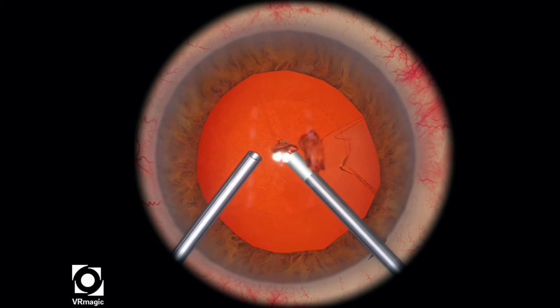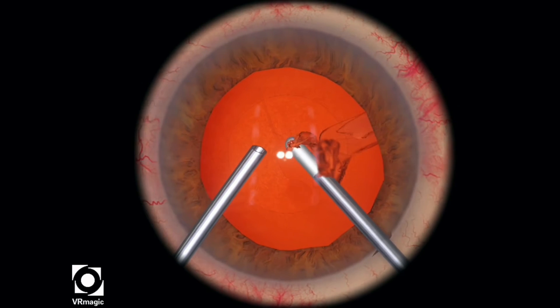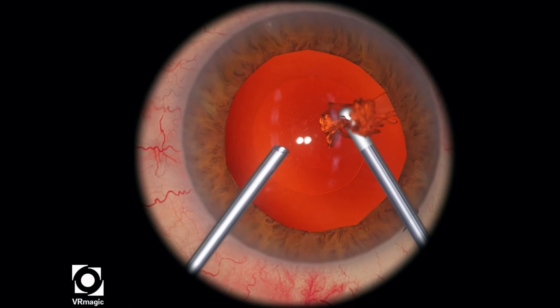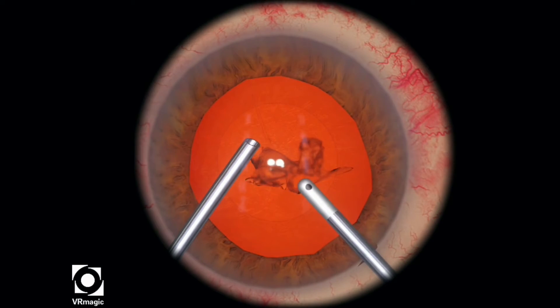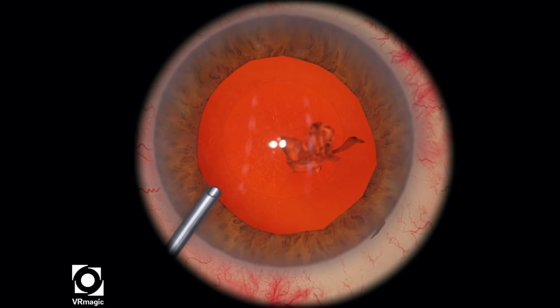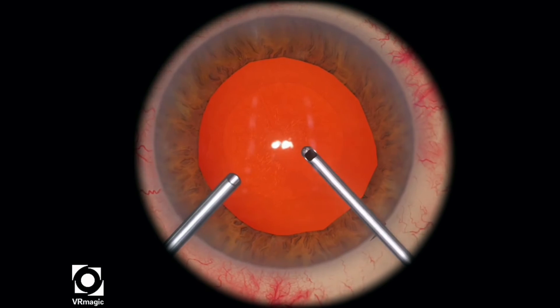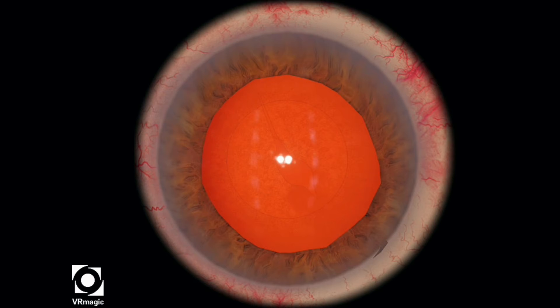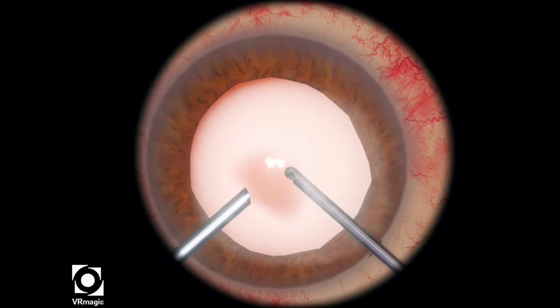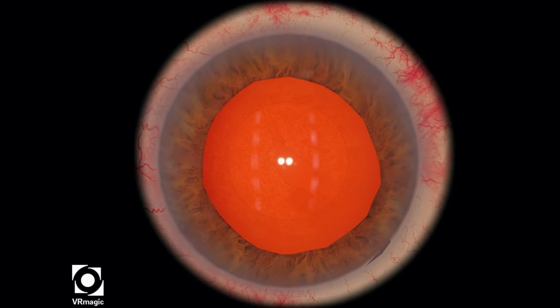You notice that when I grasp the cortex, I'm actually not able to chew it up or consume it with the IA tip. So what I do, because my flow setting is so low, is that I actually just pull all the cortex away from the capsule. And then I use my vitrector to actually consume or get rid of the remaining cortex. You can see my vitrector cutting up the rest of the remaining cortex. The reason I'm doing this is because when I experimented with regular IA settings, the machine complained that the irrigation aspiration settings were too high — the irrigation was too high and the flow was too high — and they deducted me points. So you have to treat it almost like the level with weak zonules, and that actually got me to score 100 on this particular level.